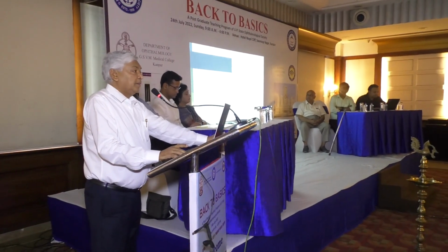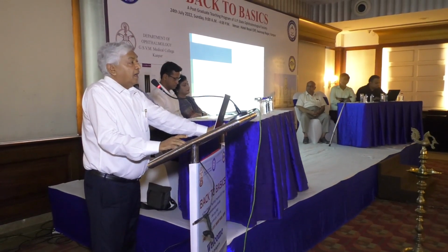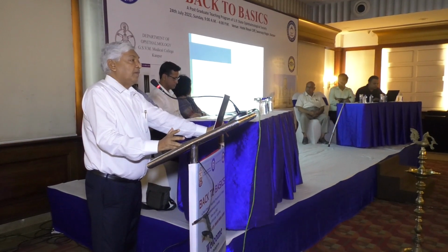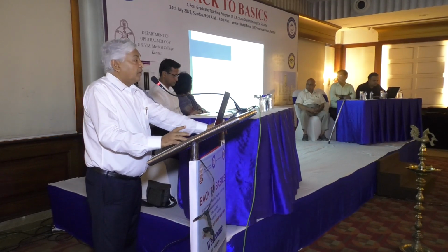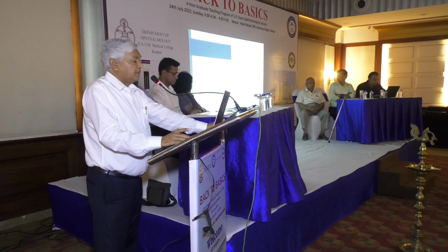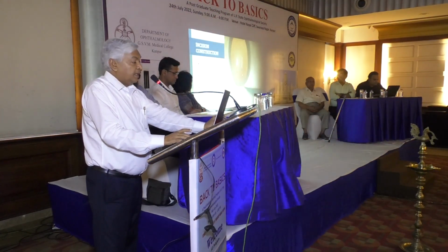If there is leaking, there will be a lot of fluctuation in the anterior chamber, and you can invite many complications. Similarly, the incision is also very important to control astigmatism. The capsulorhexis I will discuss next.